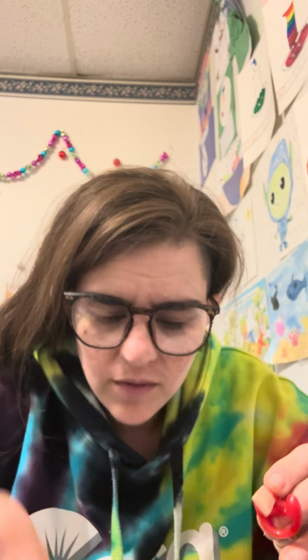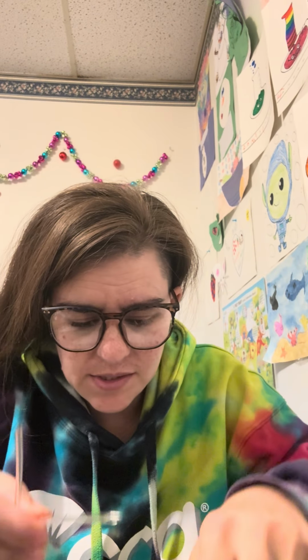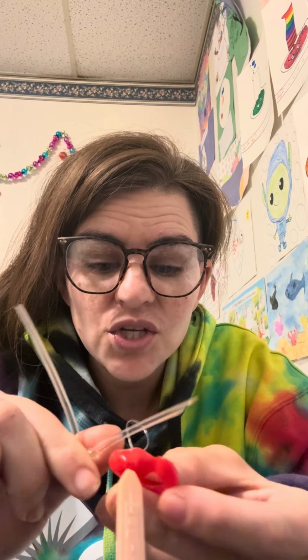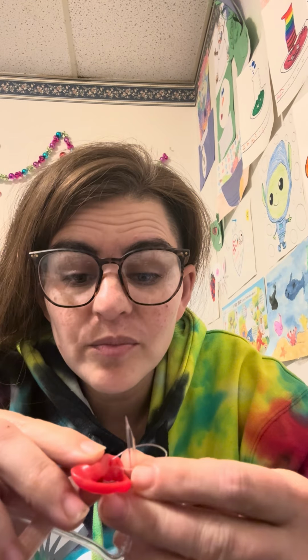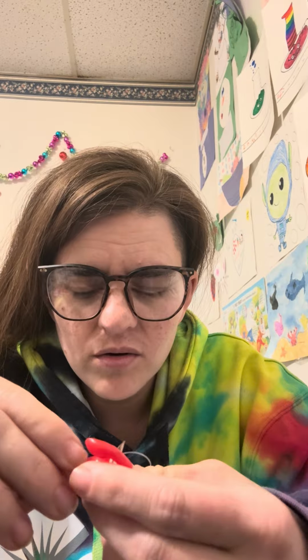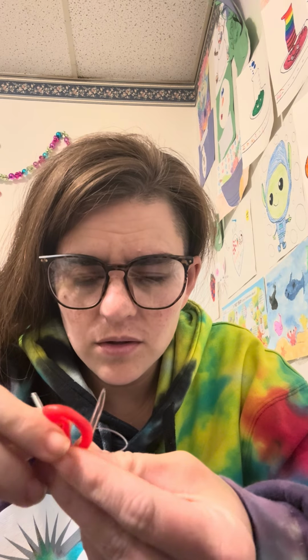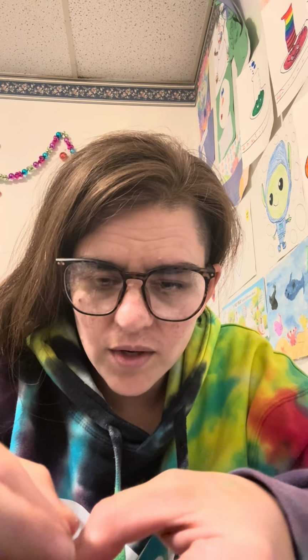And you see how one end of the tubing has a pointy side. You're going to stick the pointy side through your clear loop, okay? And don't stick it too far in like this, just the tip. And then you're going to hold it in the loop, just the tip sticking out, going that way, out. So then you're going to just pull the loop while holding the mold. It's easier if you do it on a table, but holding the mold with one hand and the tubing with another, like this. So you can hold it all in one hand, see?